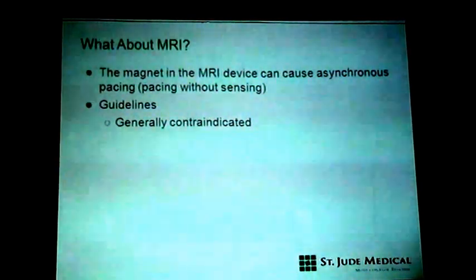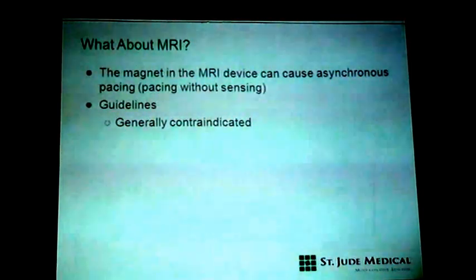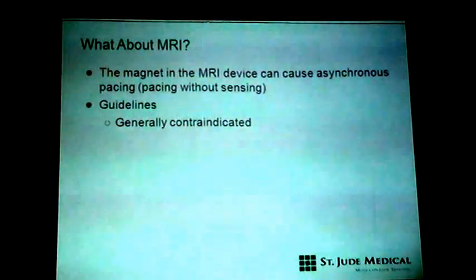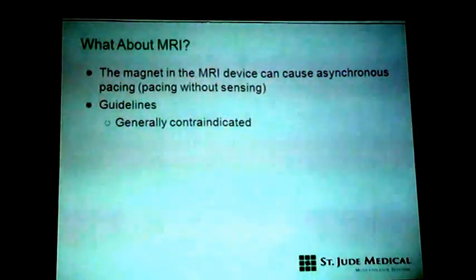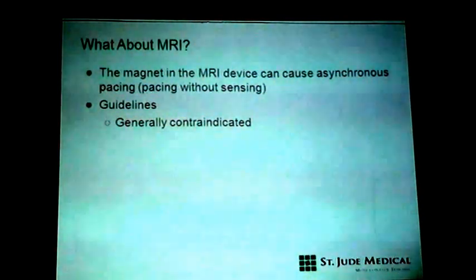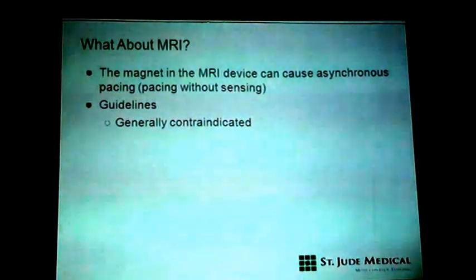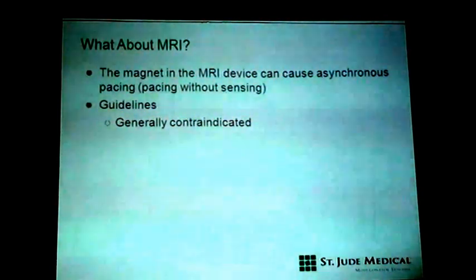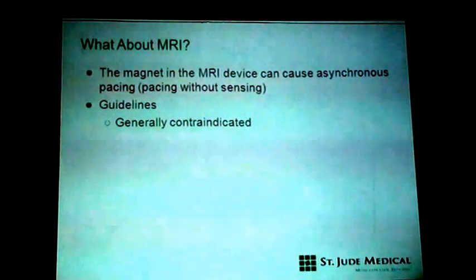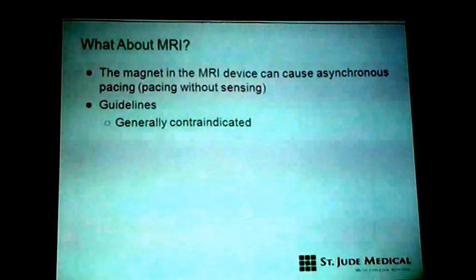MRI, most of the patients... recently, last month, one patient with a pacemaker came with a stroke. Our neurologists advised an MRI, and our house surgeon and I also signed it. We sent the patient, and they gave a date after 7 days. Two times we requested them to do the MRI as early as possible.